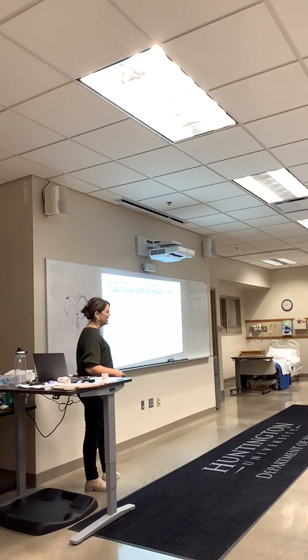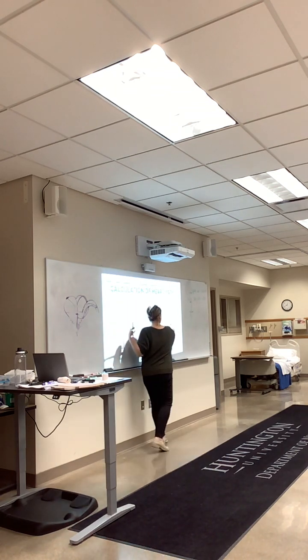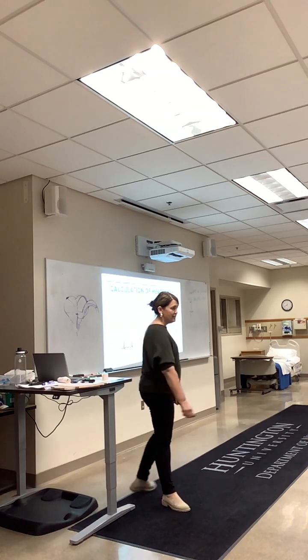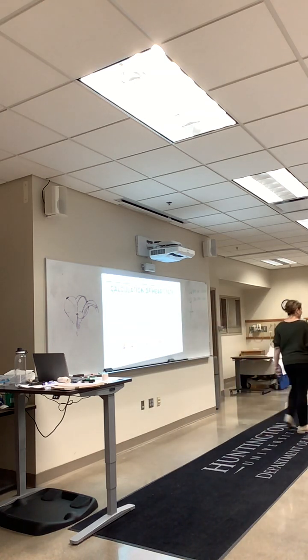I talked about the 6-second thing that's going on here. So basically, here's my 6-second strip. I need to count in between these divots how many peaks I have, multiply by 10. That's my heart rate. So if you're doing a quick glance, 1, 2, 3, 4, 5, 6, 7. 7 times 10, that heart rate is 70. That's easy. You're like, that's the easiest thing you told me all day.